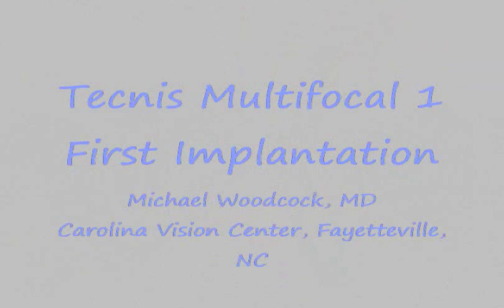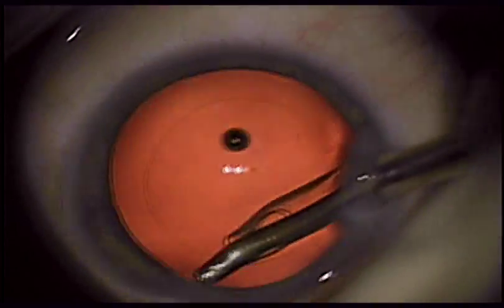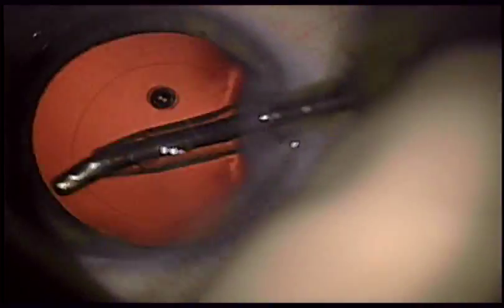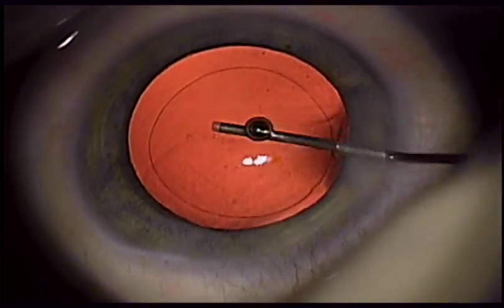This video shows implantation of a new model of the Tecnis Multifocal. This implant is called the Tecnis Multifocal 1. It differs from the standard Tecnis Multifocal in that it is a one-piece intraocular lens.